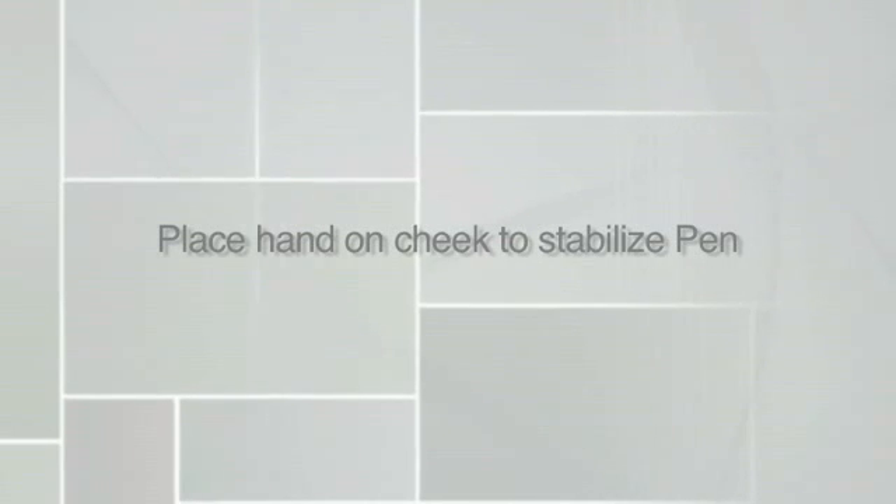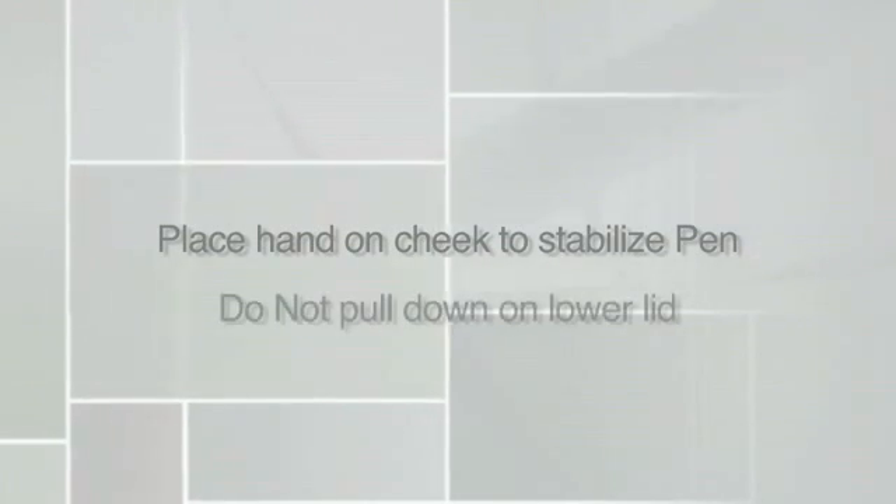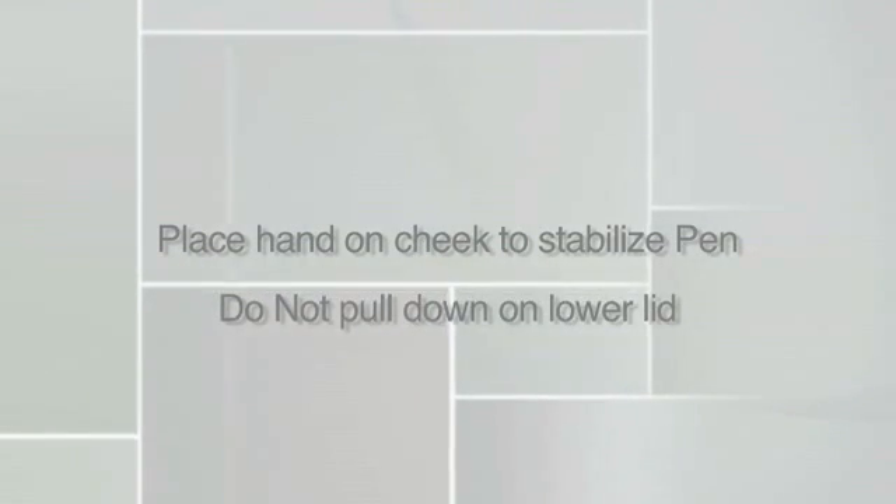It's okay to place a hand on the cheek to stabilize the pen, but do not pull down on the lower lid as the tear lake will disappear, making tear collection difficult.